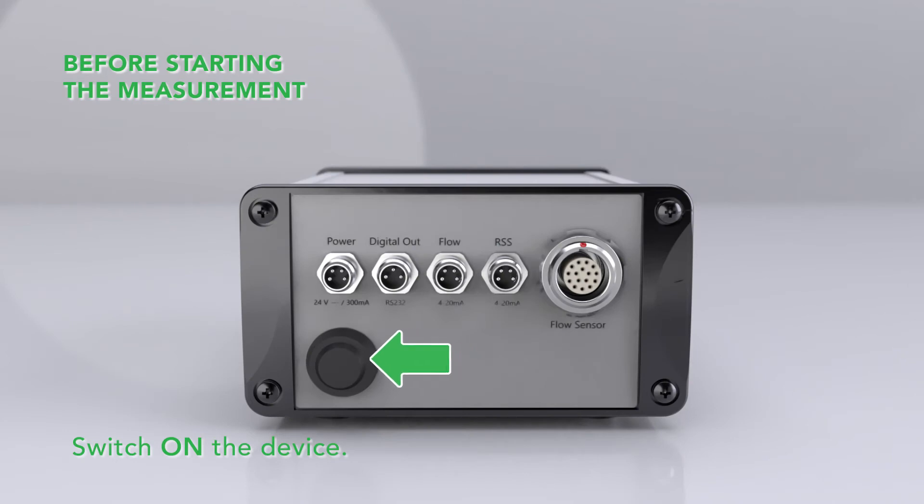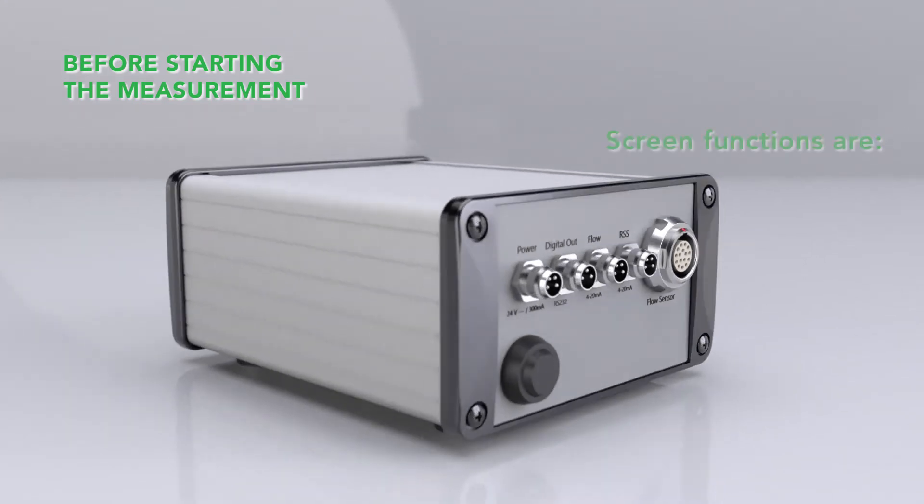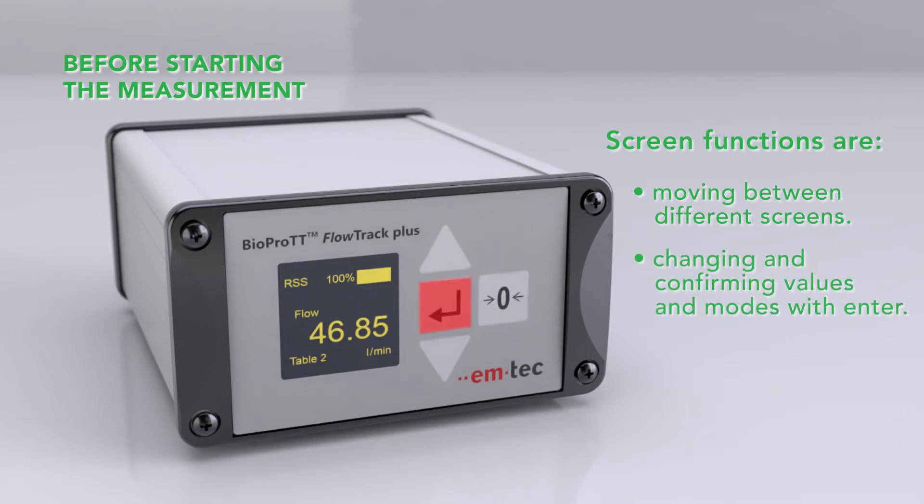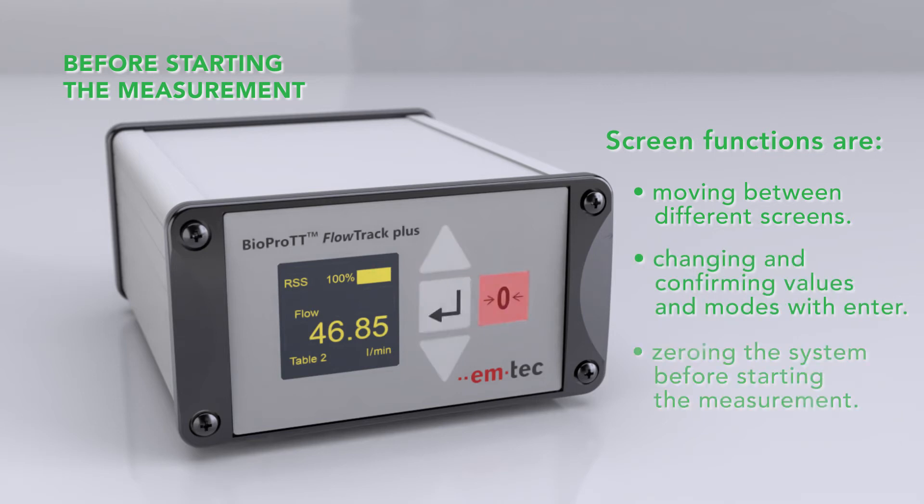Switch on the device using the power button on the back of the unit. The screen functions on the front include moving between different screens, changing and confirming values and modes with enter, and zeroing the system before starting the measurement.